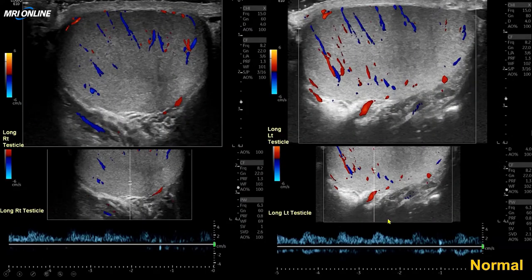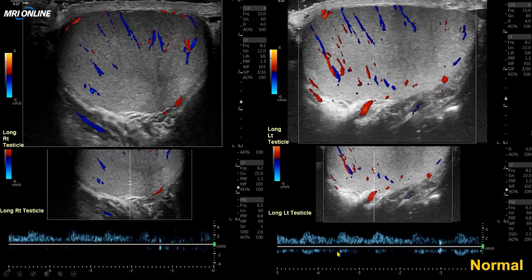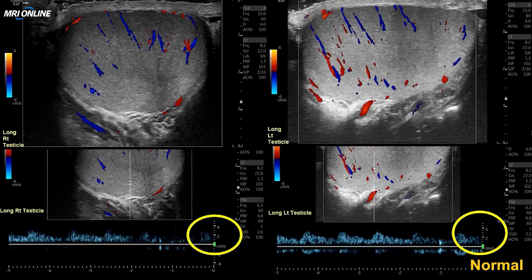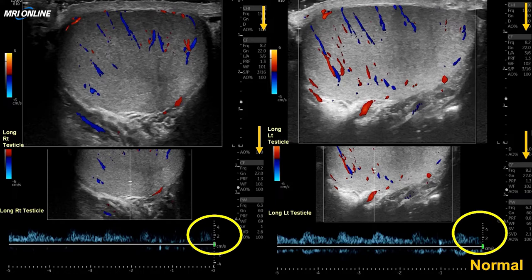Here's another case of normal. When we compare the color Doppler from side to side, it's very symmetric. The grayscale features are very symmetric, and we have very symmetric waveforms. It's important to note whether the settings are symmetric to know that the waveforms are truly symmetric. In this case, the scale is the same from right to left, and if you look carefully at the setting numbers, they are identical from side to side. The sonographer should maximize how you look at the asymptomatic side and use the same settings on the other side.